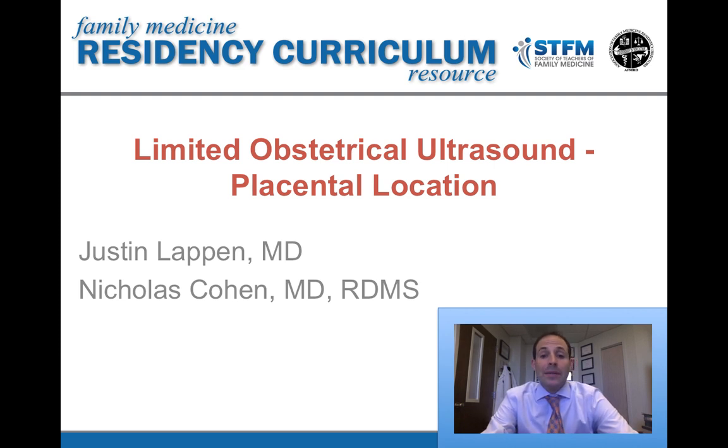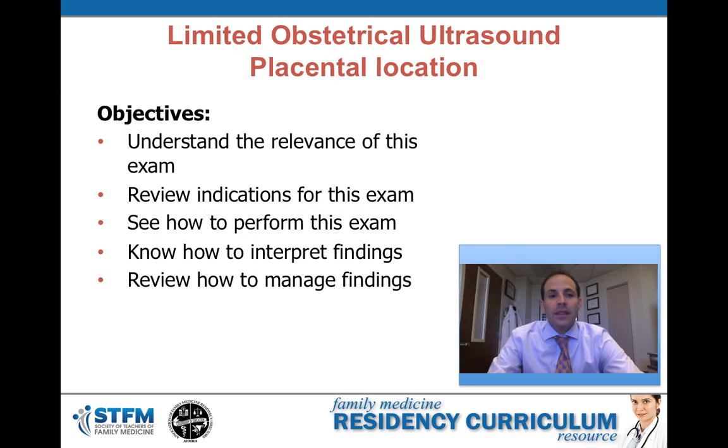Welcome to our module on limited obstetric ultrasound of the placenta and localizing a placenta. Our objectives of this module are to understand the relevance of identifying the placental location, the indications for this exam, how to perform this exam and interpret the findings, and how to manage the findings that you identify.